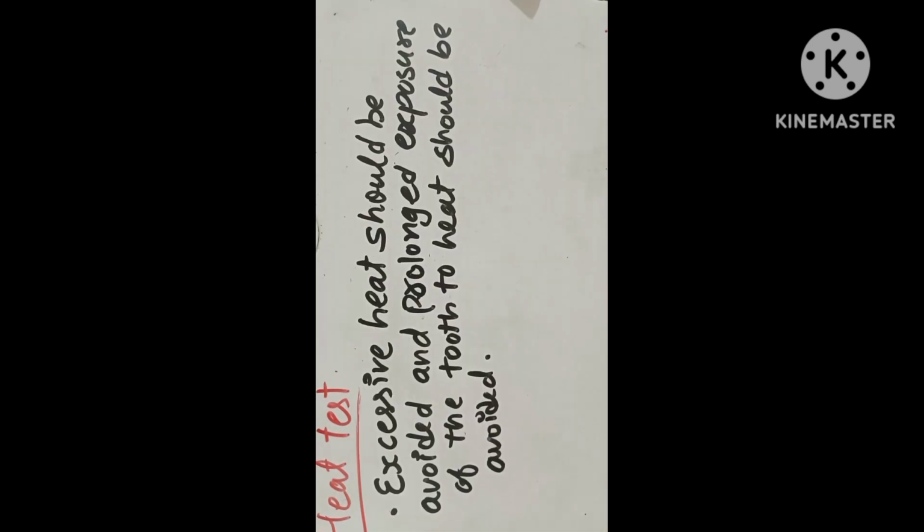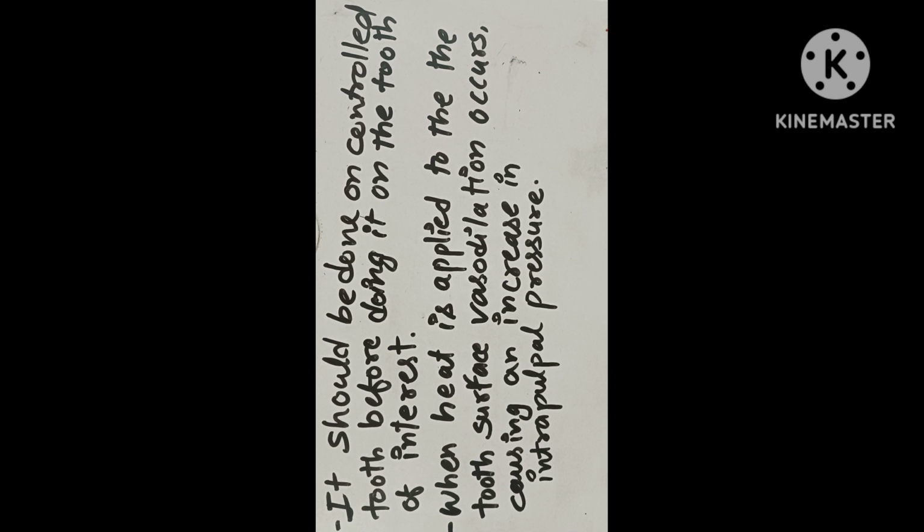The stimulus should be removed as soon as a response occurs, and the heat test should be applied for no longer than 5 seconds. Excessive heat should be avoided, and prolonged exposure of the tooth to the heat should be avoided. It should be done on a control tooth before doing it on the tooth of interest.